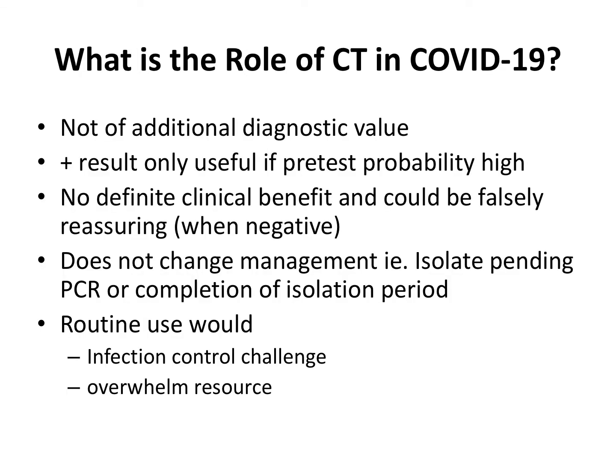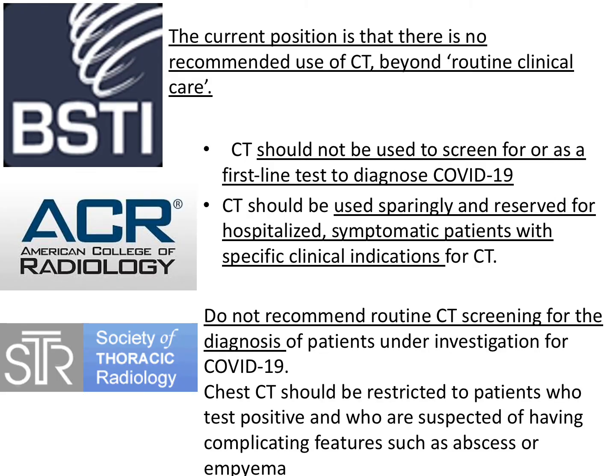What is the role of CT? To summarize, really, it is not of additional value in patients who have typical clinical presentations. And that summary has been supported by each of those professional bodies, particularly in the UK, United States, and Europe, which do not support the routine use of CT, preferring to use it as a problem-solving tool when imaging findings and clinical features are disproportionate, non-concordant, if you like.